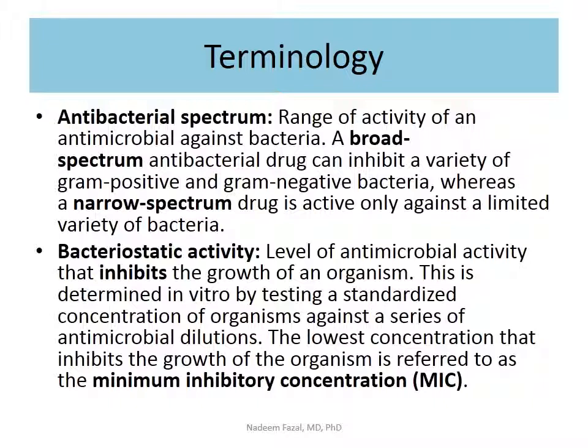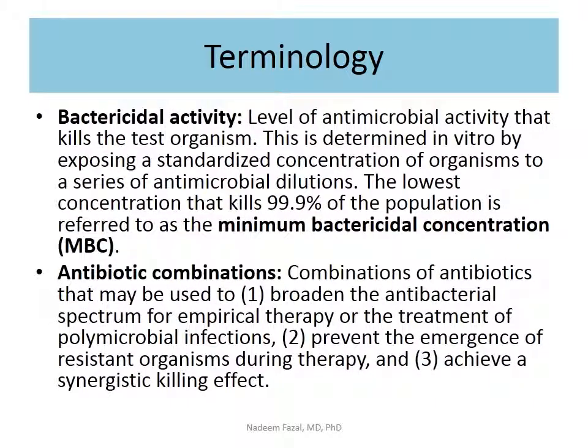And then we also want to find out how much we need, because we don't want to overkill. You don't want to use too much antibiotic. You remember where that is coming from? Because of disruption of normal flora. You don't want to do that. So you want to go for the minimum possible drug concentration. We call it the minimum inhibitory concentration. That's why you check on the plate, and you have to look at the dilutions and so on and so forth. Okay?